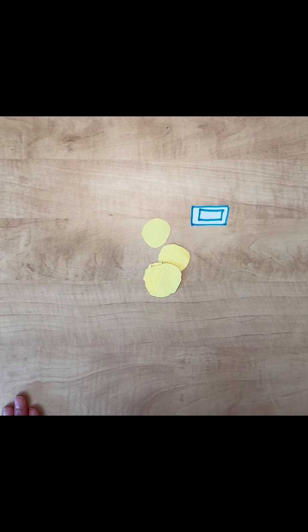So first off, we can look to the CBC to tell us whether we have sufficient numbers of platelets. Then, to test platelet function, we can do platelet aggregometry, which is basically how fast a light shining through a test tube of platelets is made more dim because the platelets are glomming up together. We can also perform a clot retraction test, where we see how fast a blood clot in a test tube shrinks and releases serum.